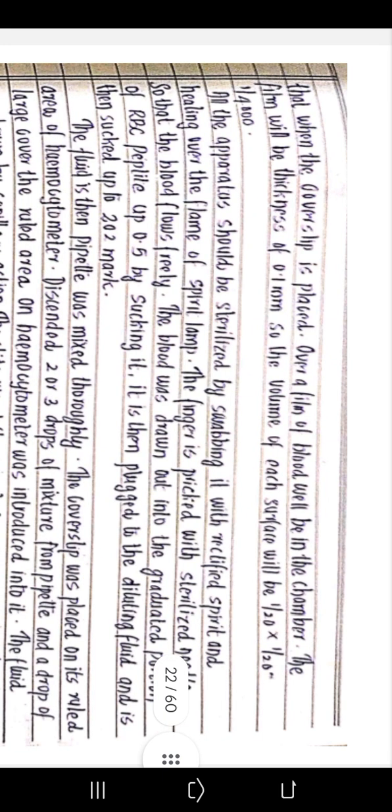All the apparatus should be sterilized by swabbing it with rectified spirit and heating over the flame of a spirit lamp. The finger is pricked with a sterilized needle so that the blood flows freely. The blood was drawn out.